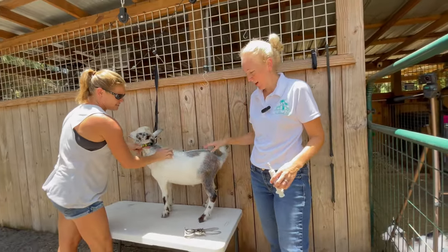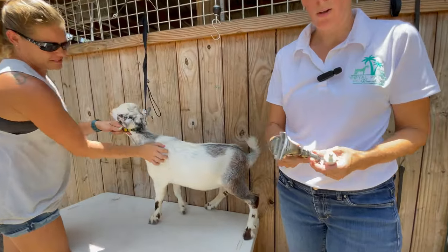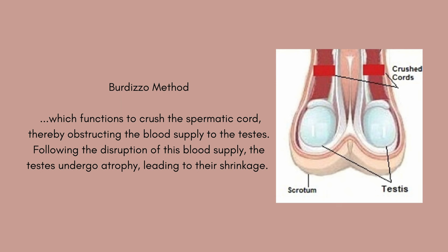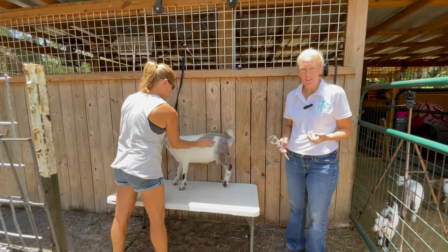Today we are going to do the Brezido method of castration. We have our Brezido emasculating pliers right here — this is what we use. What it does is clamp the spermatic cord, which cuts off blood supply to the testicles. They don't shrivel up and fall off like with the banding method, but they do noticeably shrink in size. He gets to keep them, but they just don't grow and don't produce testosterone.